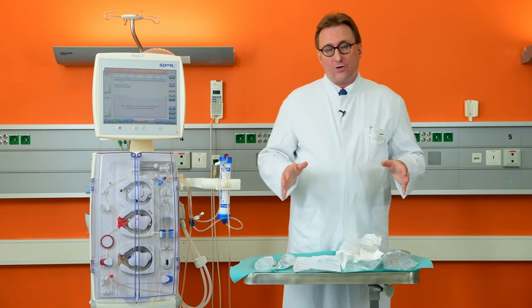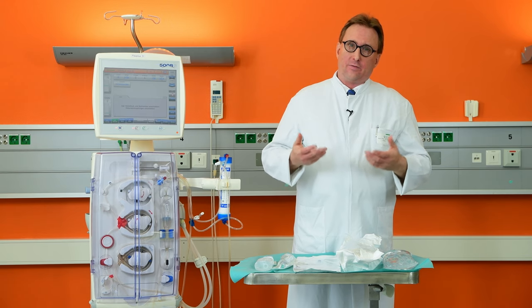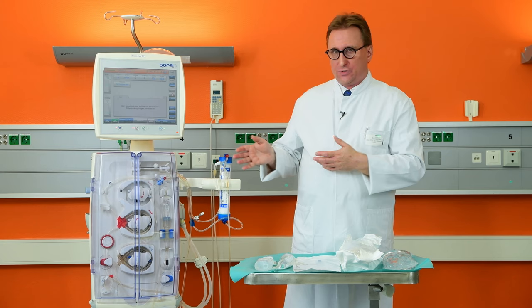In addition to those components, you also need female Luer blood tubing to connect the filter to the dialysis tubing system.